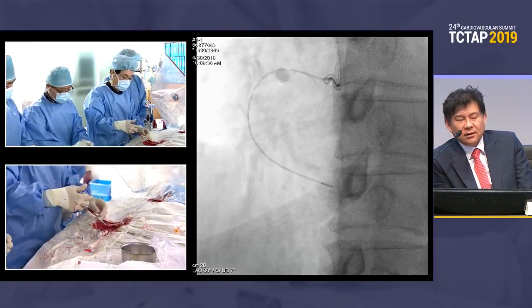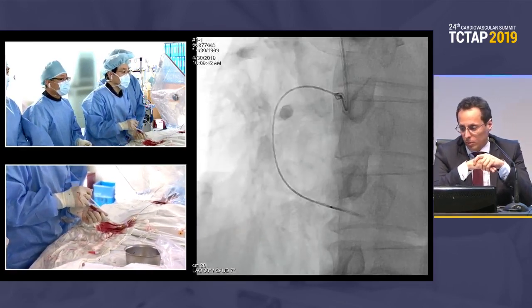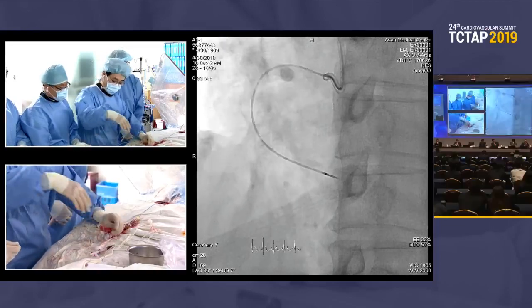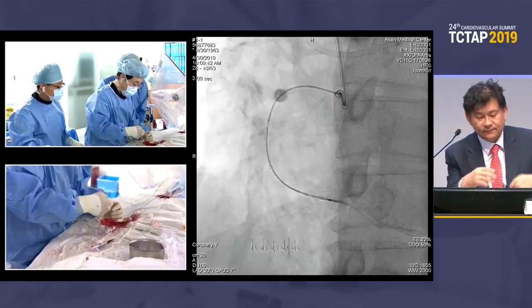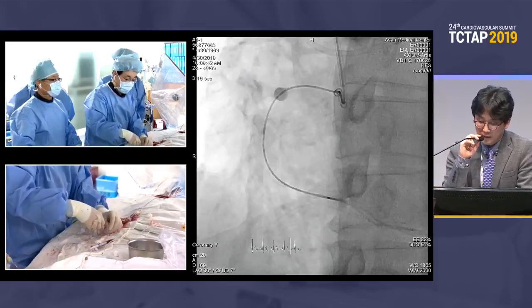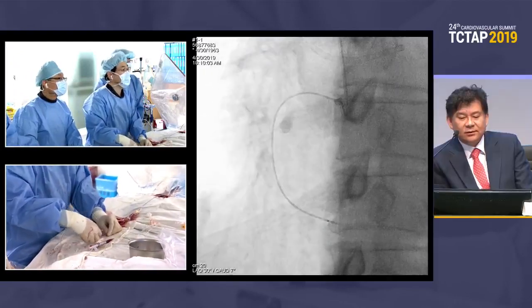Because if the wire goes to the distal posterolateral branch, I don't see the point. Yeah, because the contralateral is weak. If you could confirm that during injection, Sion, please. Sometimes balloon induced dissection, you can make the dissection further. So it's not good to do it. Sion? Yes. This image makes the operator very comfortable, but I also agree that tip angiography is not always needed. Most tips will be okay, but you have to consider any event during this procedure.